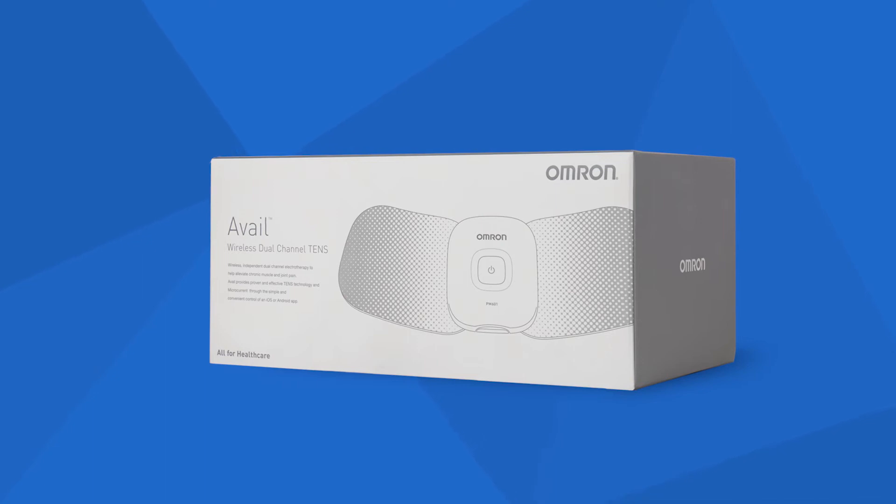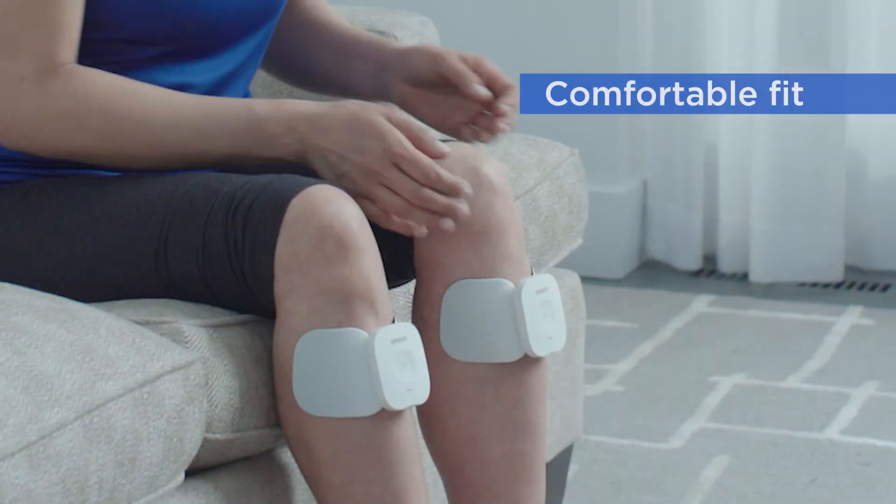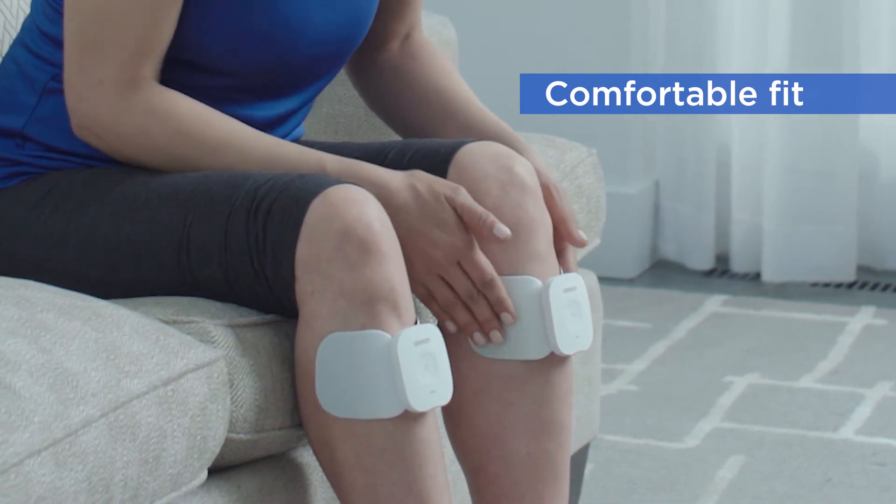Avail is our premium wireless dual channel device. It combines TENS technology and microcurrent therapy to treat both chronic and acute pain.